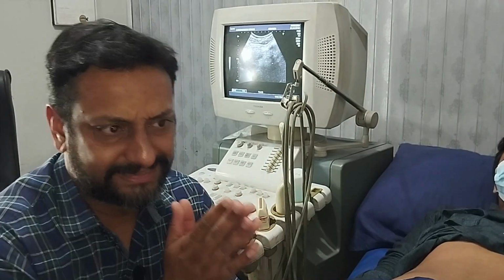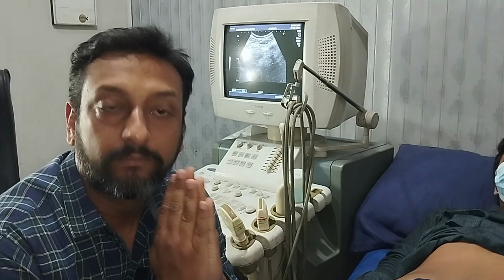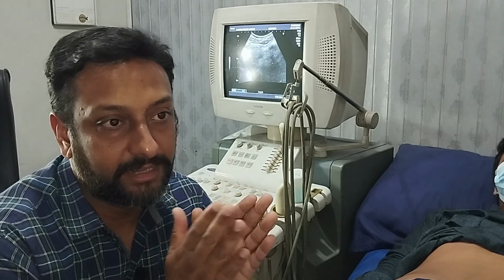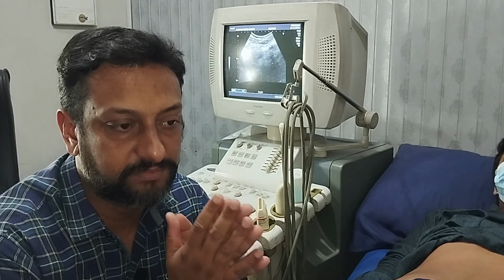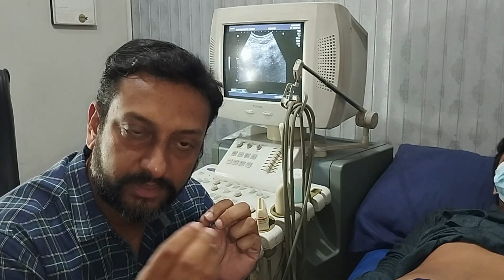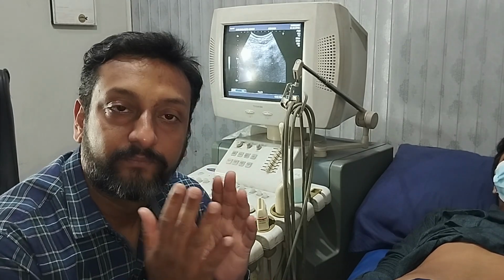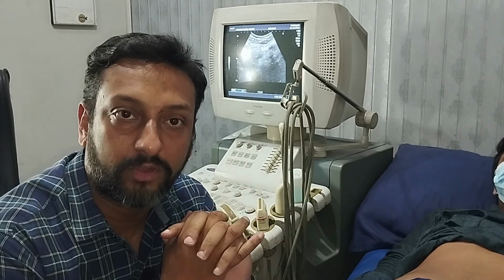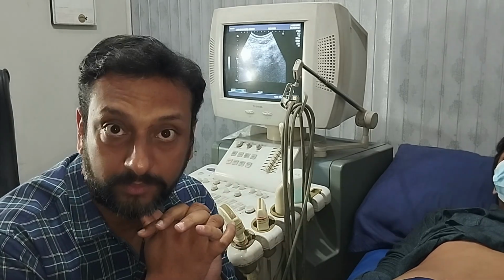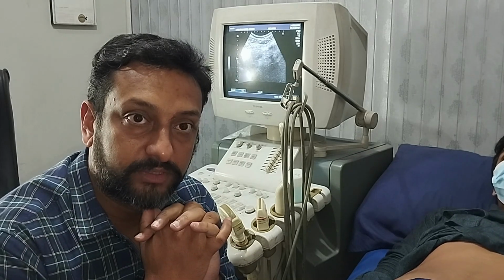But there are some tricks. Number one, keep your hand steady, apply adequate pressure, and if on applying pressure the gases are not displacing, then give intermittent pressure. Apply the pressure, release it. Apply the pressure again and release it. We have to keep in mind that applying the pressure should not be giving pain to the patient. It should not be tender. So we have to give adequate pressure.